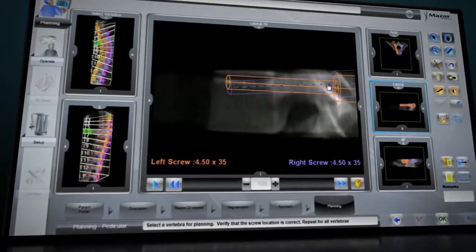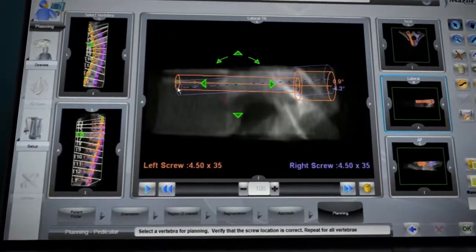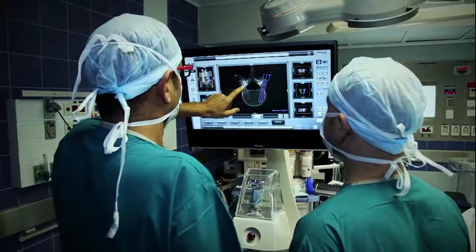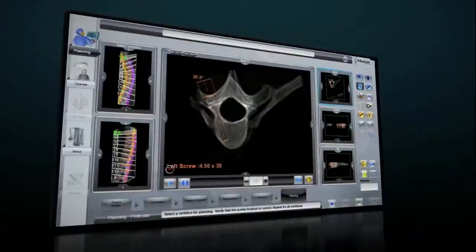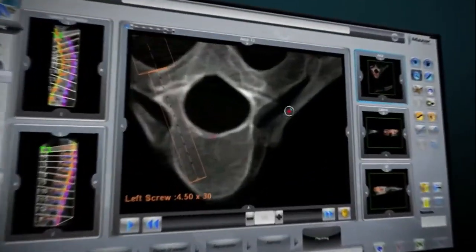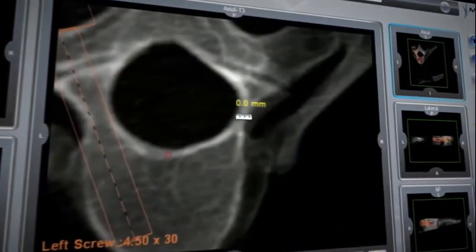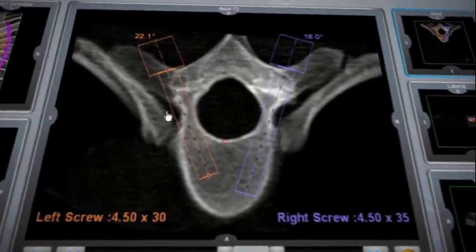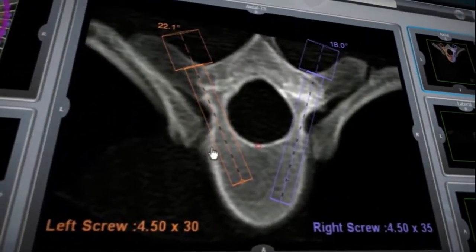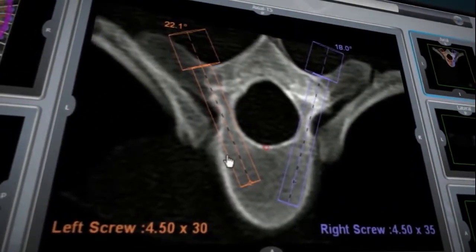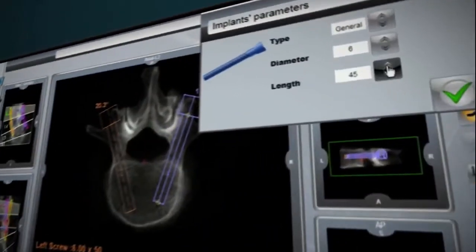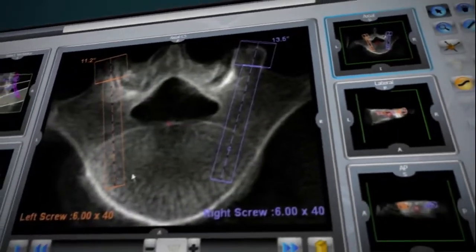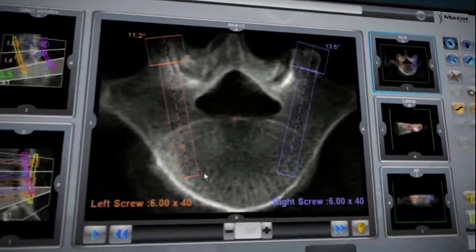Renaissance's preoperative planning provides many advantages, including identification of possible challenges such as hypoplastic and asymmetrical pedicles. Better assessment of the patient's anatomy can help the surgeon determine the most optimal implant sizes for better bone purchase and strategic placement.